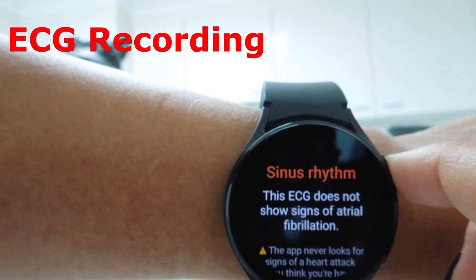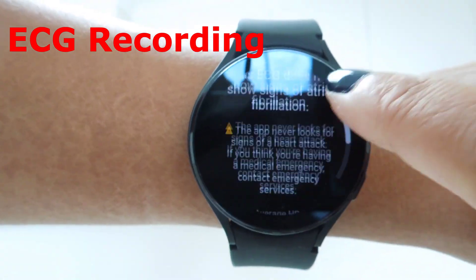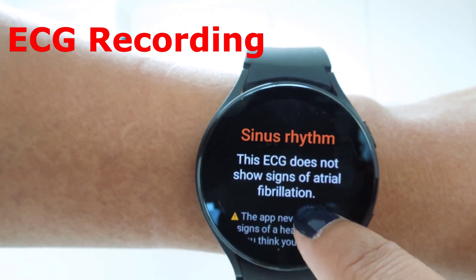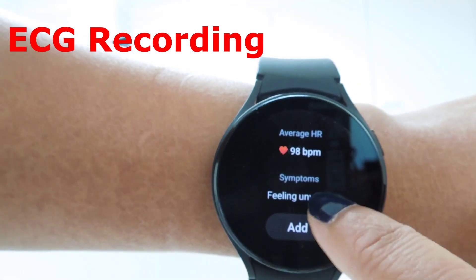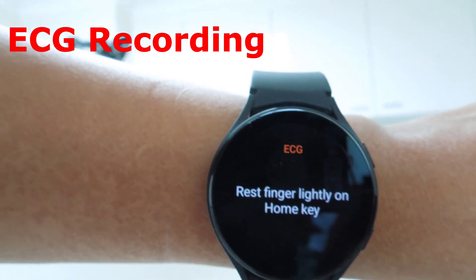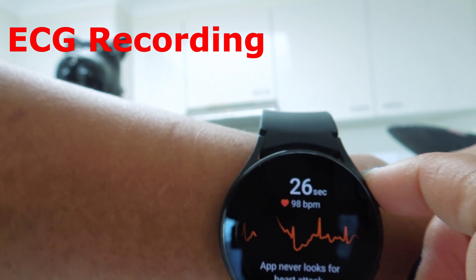The watch has finished recording the ECG and gives the result: no signs of atrial fibrillation. It also shows the average heart rate. You can add any symptoms if you're feeling unwell, then click done. You can take a second ECG the same way by keeping your finger on the home key.